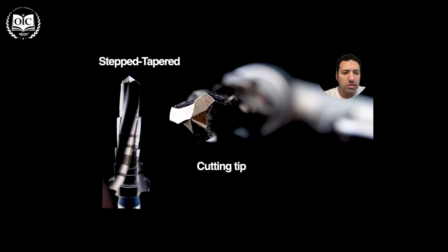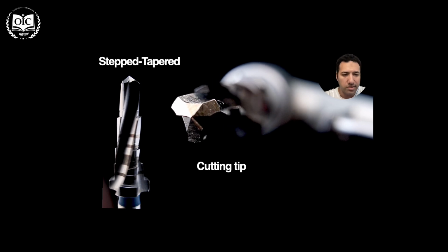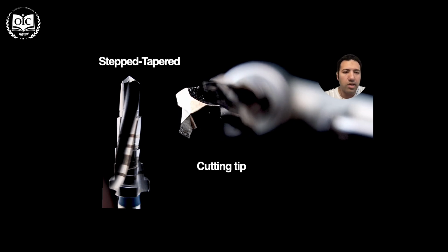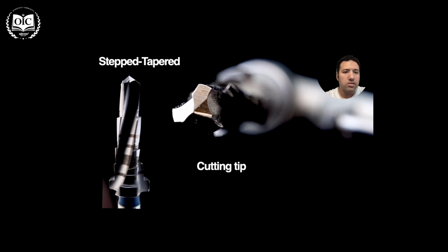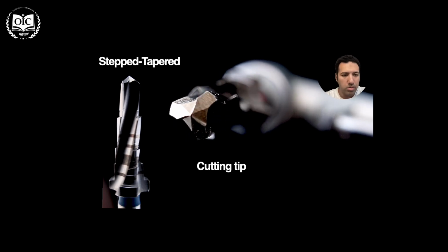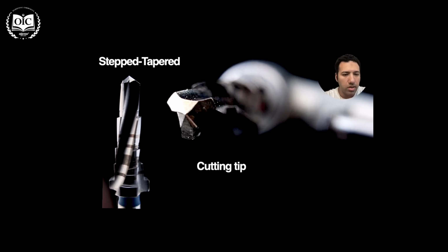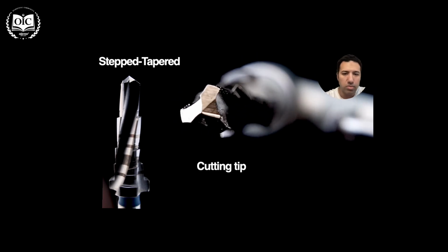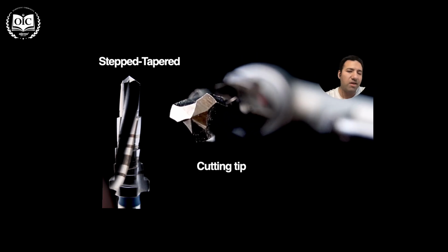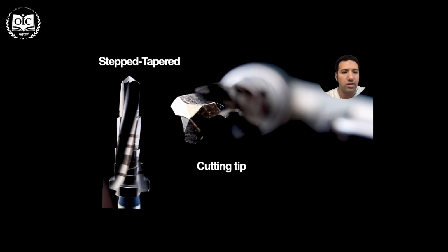The tip design, we also have a sharp tip design. It's not super sharp that can injure vital structures like nerves and sinus floors, but it's not a passive tip. You can just increase a little pressure and go 0.5 millimeter, sometimes 1 millimeter with the 3.5 final drill or the 4 millimeter final drill.